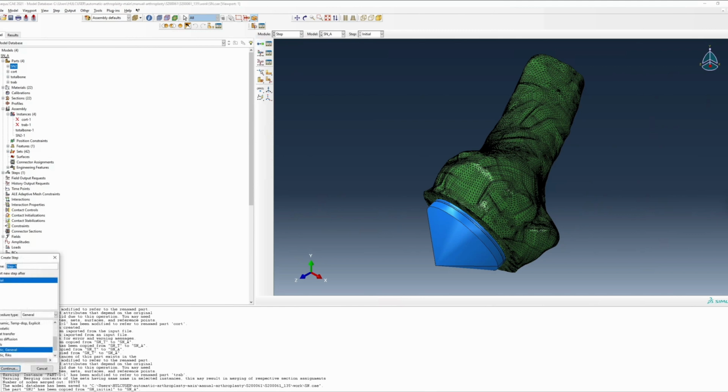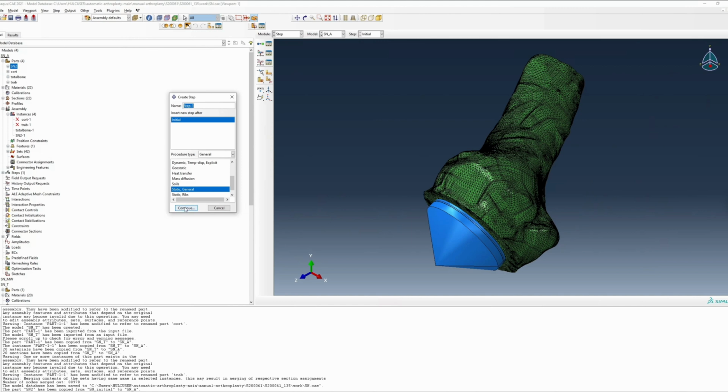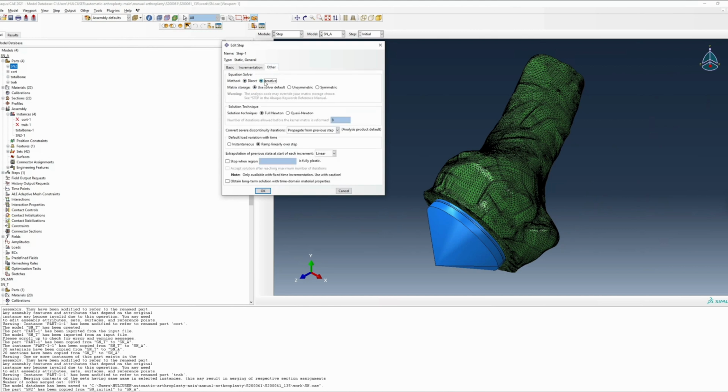Moving forward, we can begin in the step module, creating a new step relevant to our analysis. Here, I'm assigning a step with nonlinear effects active and using the iterative solver because I have more than 1 million degrees of freedom contained within my model.